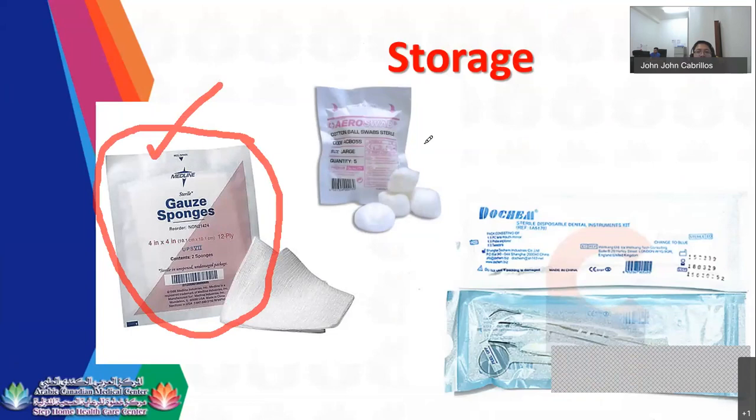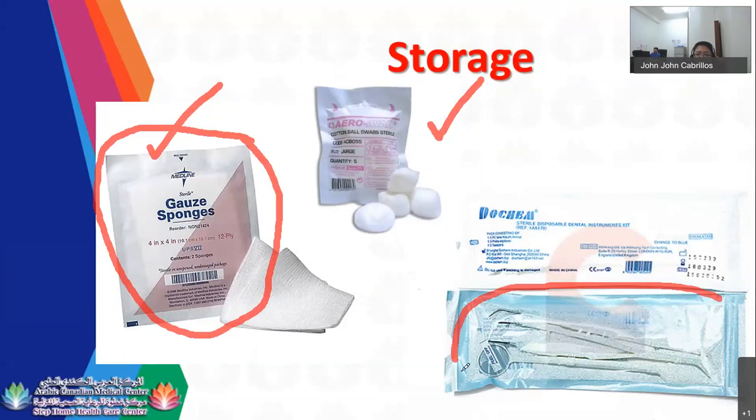For your sterile cotton balls, this is the sample. Or if ever there are disposable instruments which are sterile, this is your sample. For example, this one is for dental instruments. So you can place this together with the other sterile instruments. So sterile should be stored with sterile. Clean should be stored with clean.